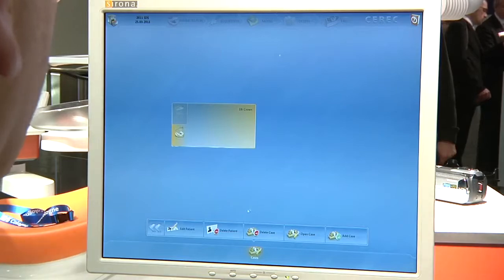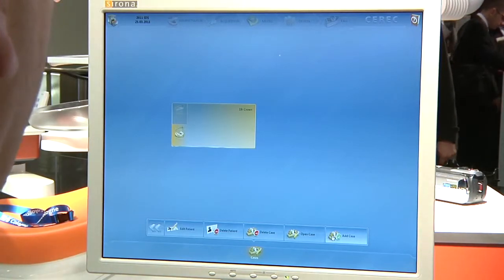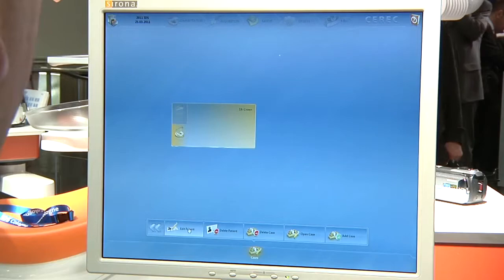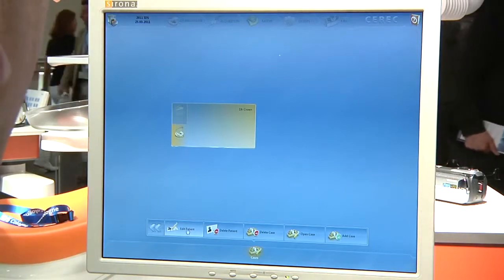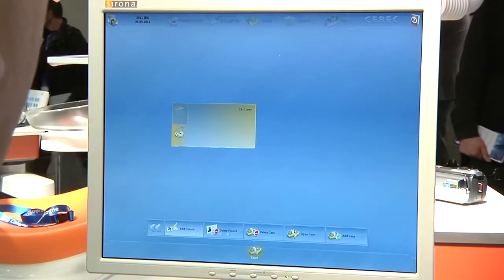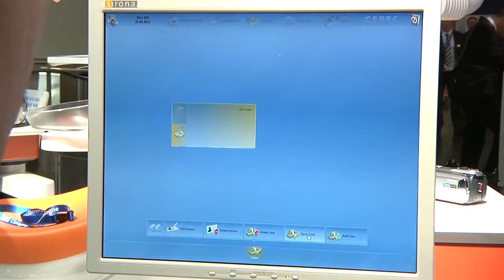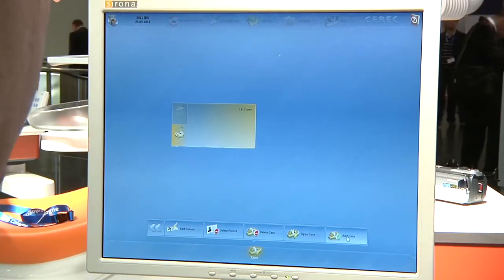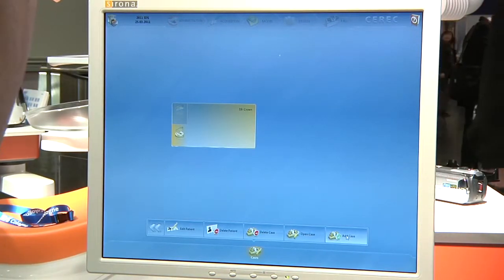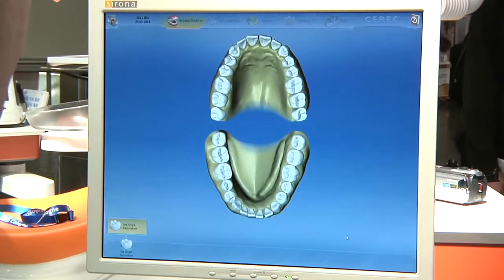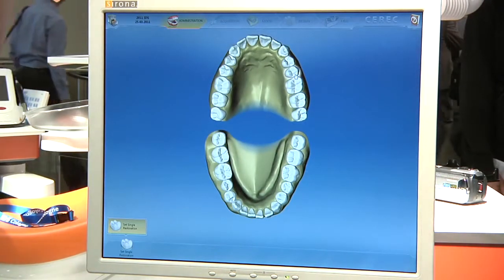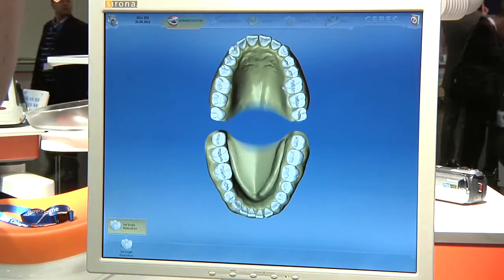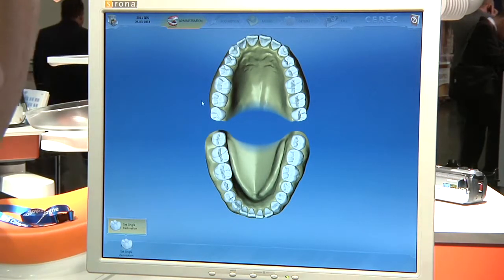I'm going to add a new case here. You can see down here, once again, we're still in administration. I could edit the patient, delete the case, or open a case that's already with the patient, but we're going to add a case here this morning. Once again, totally new, totally clean interface that we're looking at.